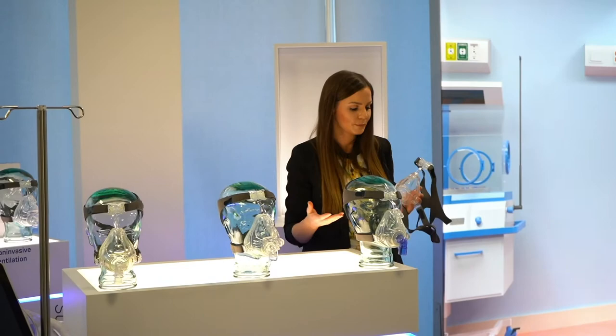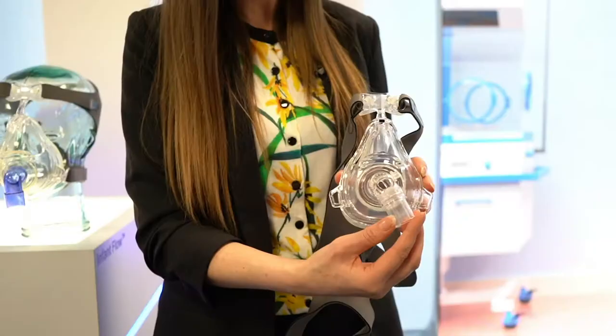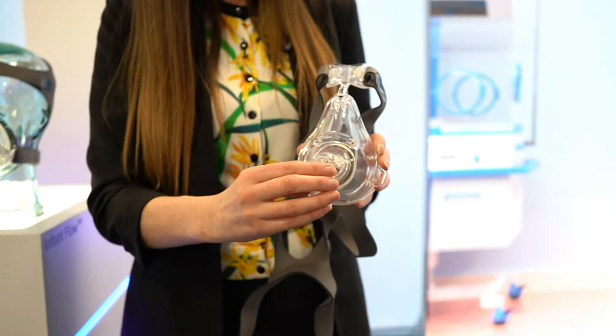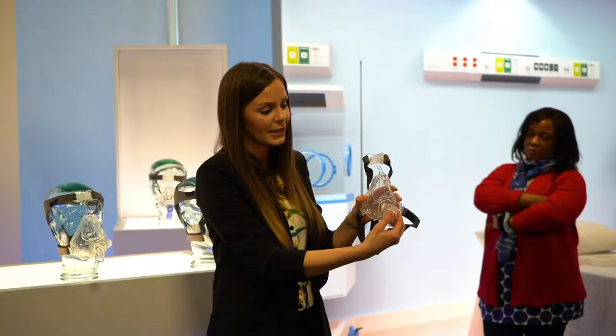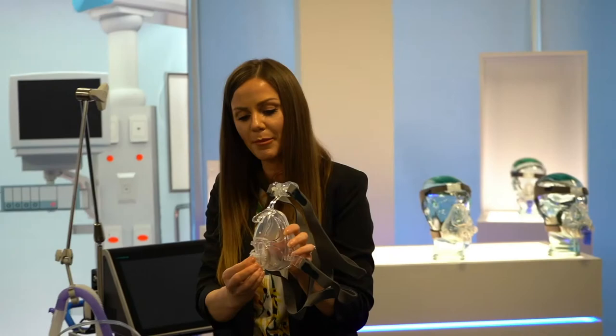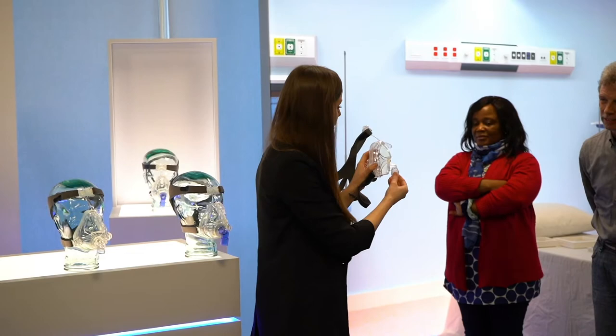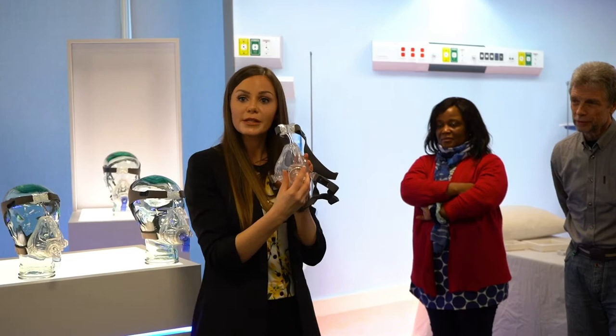What else have we got? We have a flexible dual swivel elbow. So we've got a little elbow that will move from side to side. And if you really want to, you can turn it all the way around 360 degrees. It also flexes from side to side. Can anybody tell me, have a little think about that. So that would hook up to a breathing circuit, circuits attached to my ventilator. What would be the benefit of this action if that's strapped really tightly to the patient's face? It's distributing that pressure, isn't it? What we talk about is the circuit attached to here will pull. If the patient was to turn to their side, or say, fall asleep like this, the circuit's going to pull it.